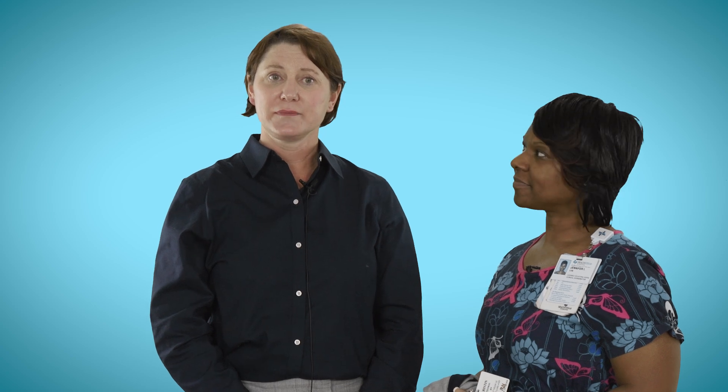You must move slowly and methodically when removing PPE and follow the steps as your buddy explains them. The equipment you will need includes two pairs of gloves — go up one size larger than you normally wear. You will also need a pair of boot covers, a surgical gown, a bouffant hair cover, a mask and goggles or face shield, hand cleanser, a buddy, and a chair. I will now demonstrate how to put on and take off PPE.